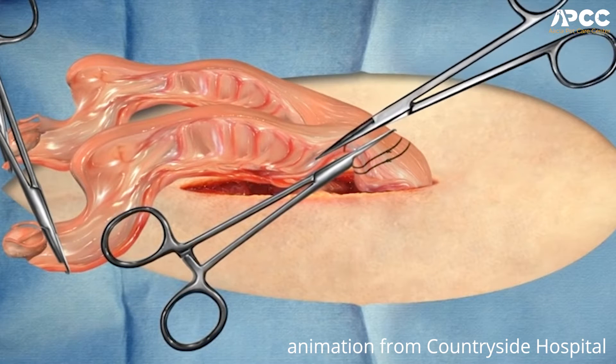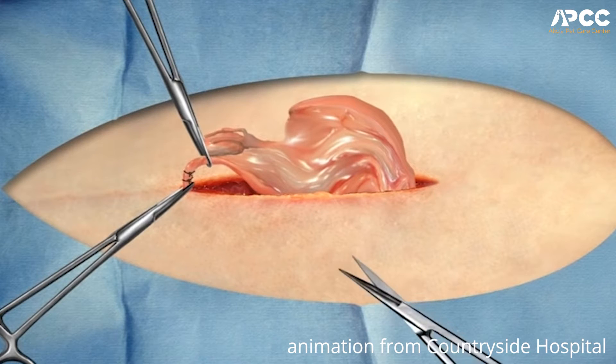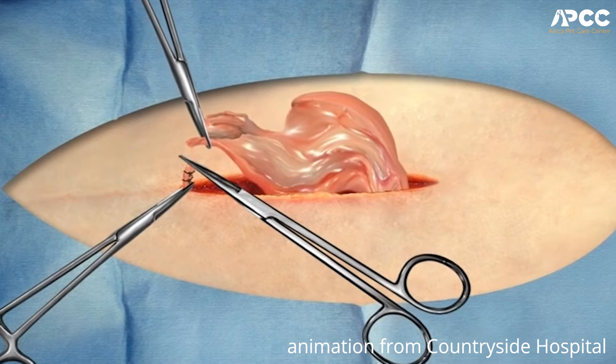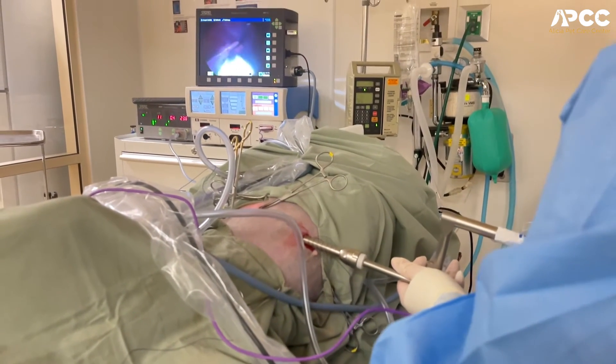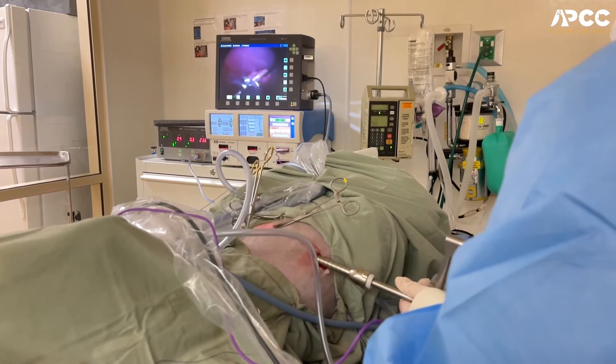In our laparoscopic spays, we're only removing the ovaries, and by doing so it is also less traumatic. With a traditional spay in the United States, we've always been taught to remove the ovary and the uterus. Both ways are completely acceptable and healthy for the pet, but one of the biggest aspects that causes pain with a traditional spay is we actually have to manually break down a ligament called the suspensory ligament, which attaches the ovary to the inside of the body wall. With a laparoscopic spay, we just use cautery — it's much less painful and traumatic — and we have very good visualization, which is one of my favorite things about laparoscopic spays: how well you're able to see everything you're doing and visualize all the organs very clearly.